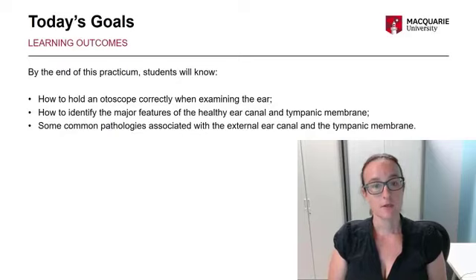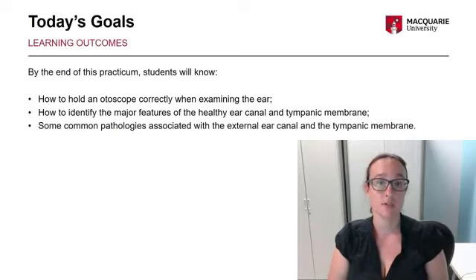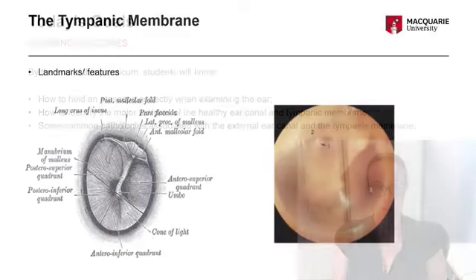We're going to talk a little bit again about how to identify the salient features of the tympanic membrane, and we're going to talk a little bit about some of the common pathologies that you might come across.